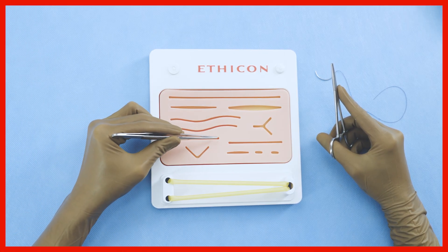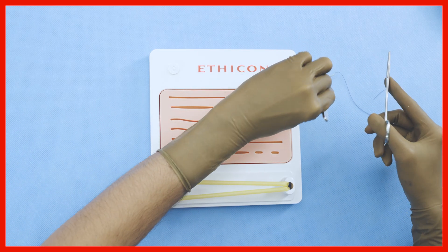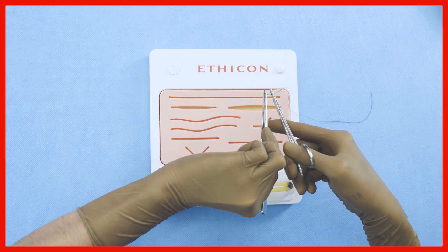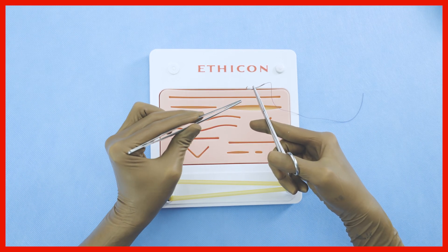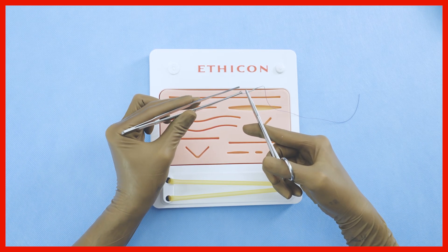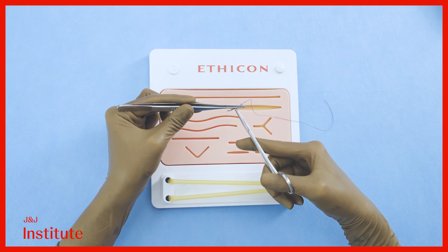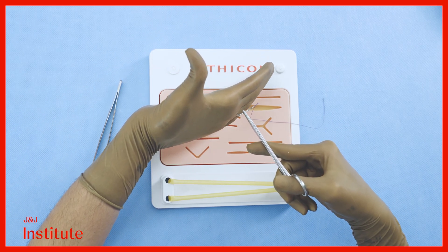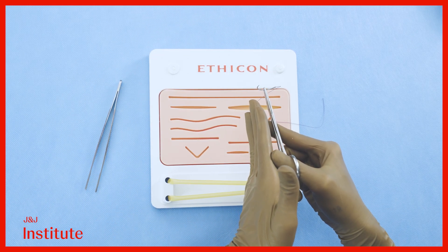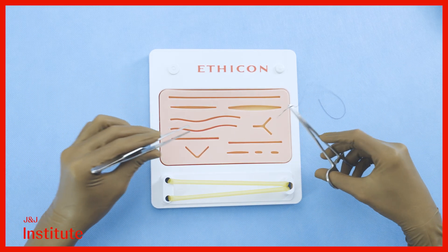The incision that you see here will be closed with simple interrupted sutures. Grab the needle with the needle driver about two-thirds of the distance away from the tip. This avoids any damage to the tip of the needle or to the swage at the rear where the suture is fixed into the needle. Ensure that the plane of the needle is at a right angle to the plane of the needle driver.